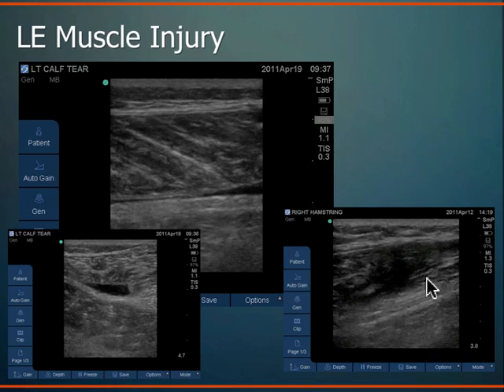So when I go see kids in the high schools, in the training rooms, where we don't have x-rays or MRIs in the high school, and a lot of these kids don't even have insurance, aren't plugged into the system, sometimes it's really frustrating and difficult for me to get an x-ray or an MRI for a kid. But I can take that ultrasound machine into the training room and slap it right on the kid's hamstring, and boom, we got the hamstring tear. Very well visualized. You can see the extent of it. How big is it? How big is the hematoma? How fast, how aggressive can we be with this kid? And I don't have to worry about him getting secondary imaging and going through all the hassles with that and expense to the family, etc. So this is one of my high school athletes just a few weeks ago with an acute hamstring tear.